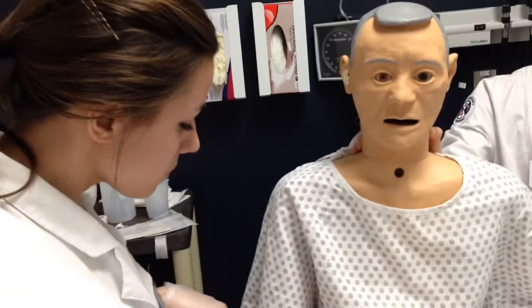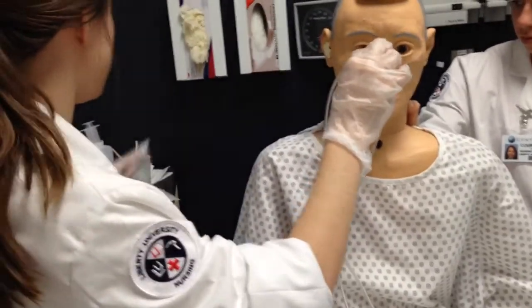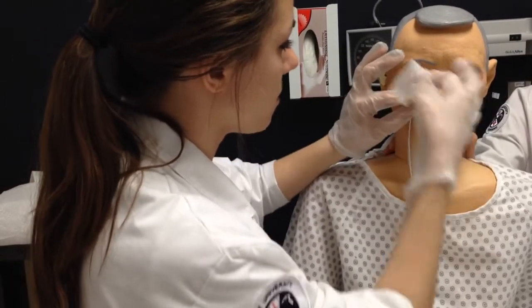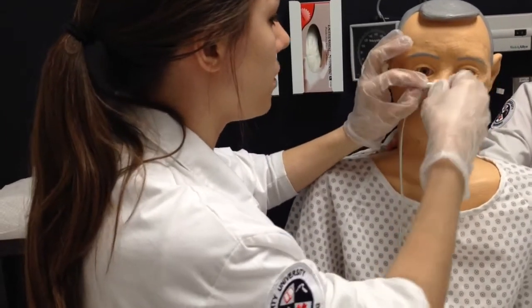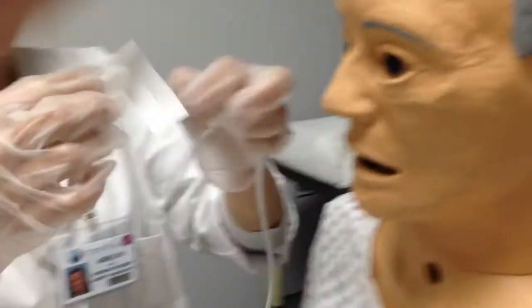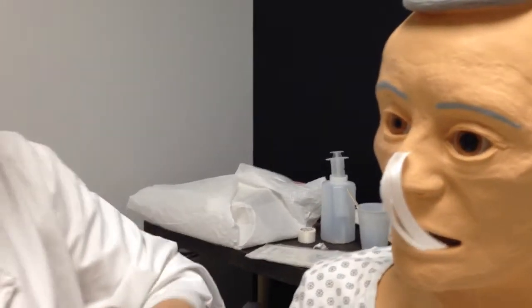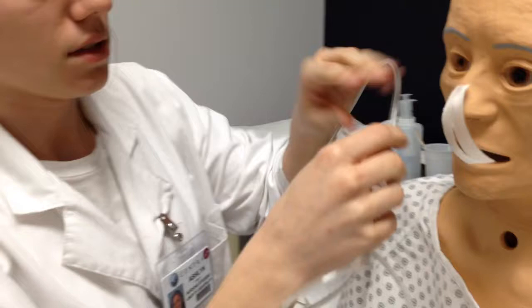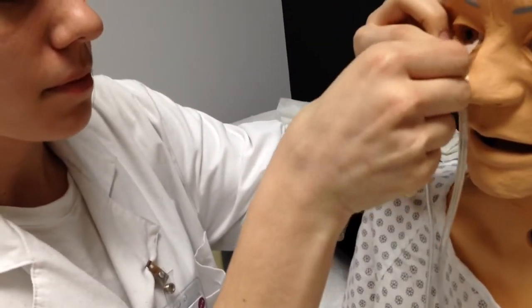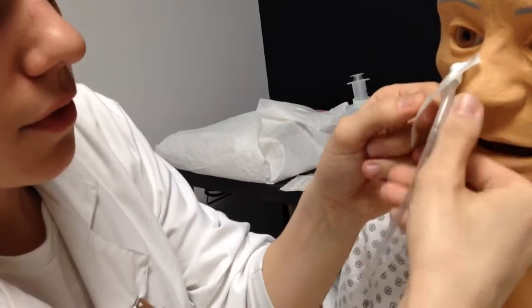And I'm going to go down to the edge of the tape mark, and then I'm going to take my tape. This would be inserted into your stomach, and we place the tape on your nose. Take my gloves off. And then we'd wrap the tape around the tube.